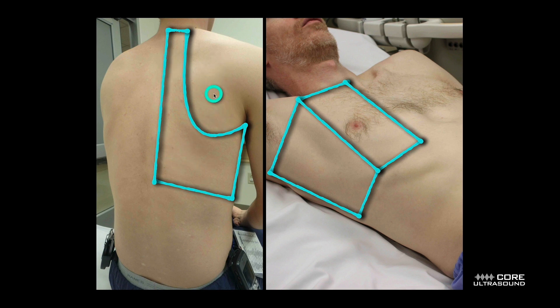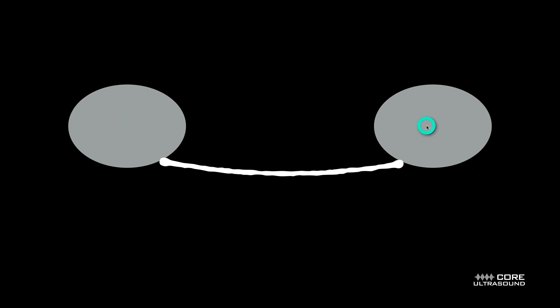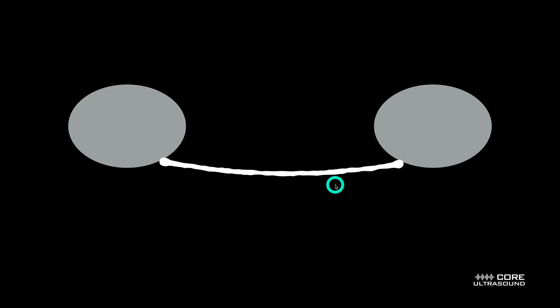You can't image through the scapula, but that's okay — you're still going to get a good amount of that lower lobe. As far as what to look for, I place the probe with the probe marker facing up on the patient's chest. That gives me a rib cross-section and the pleural line. What I want to know is: is this white line clean, or is there anything coming off of it, any dips in it? Anything other than a clean white line would suggest this is not a normal lung.